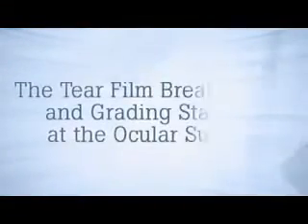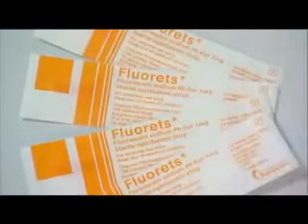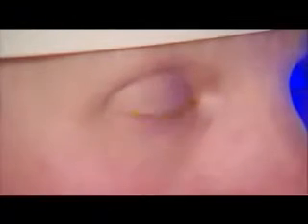The tear film breakup test and grading staining at the ocular surface. Topically instilled fluorescein is used to assess both tear film stability and ocular surface damage. Other dyes, such as lissamine green, are used to assess damage alone. Neither fluorescein nor lissamine green drops cause discomfort on instillation.